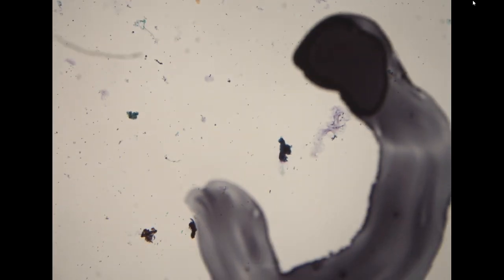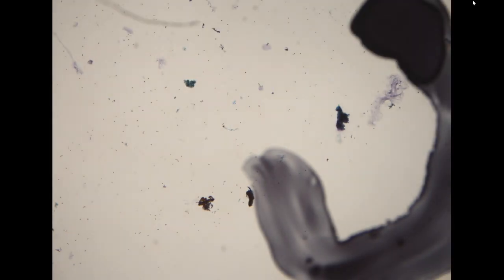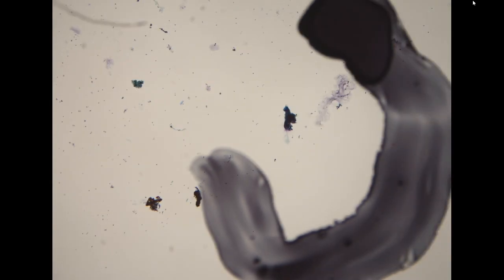The most difficult, challenging diagnosis for pancreas EUS aspiration is when we see only very scant, well-differentiated glandular cells. In that situation, it would be really helpful to have a corresponding biopsy specimen for context. For example, this case is kind of similar to our first case.